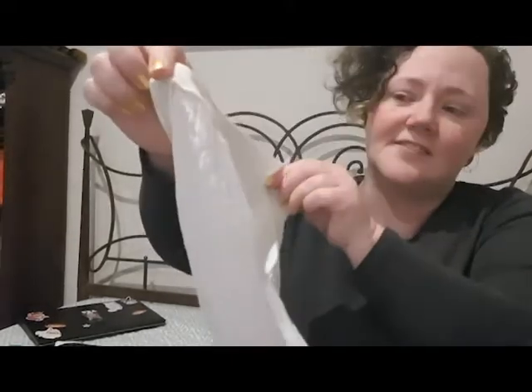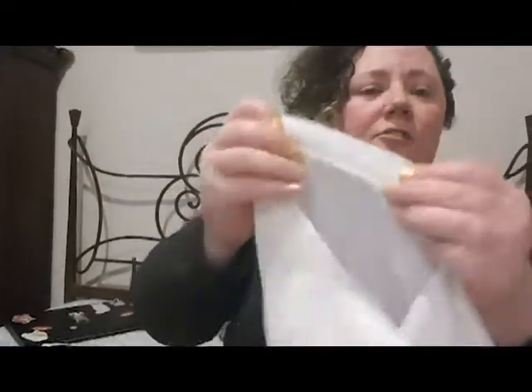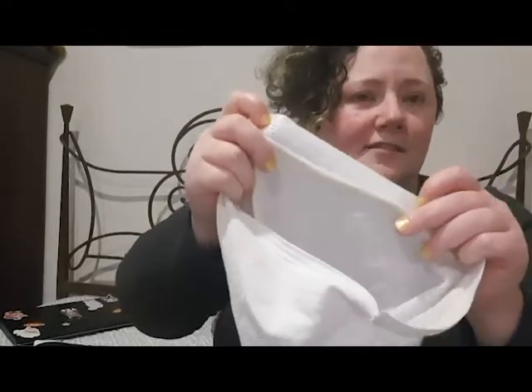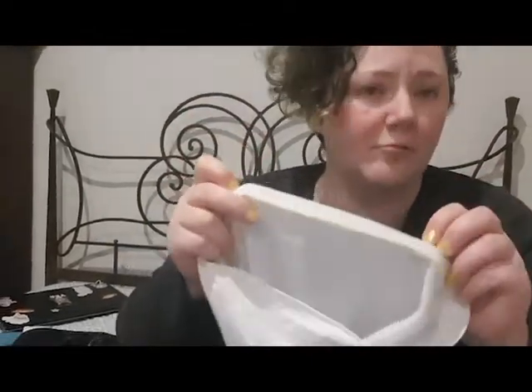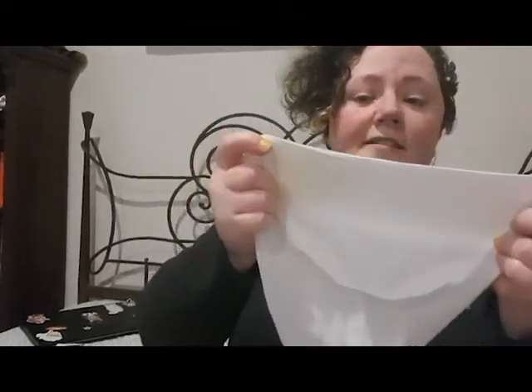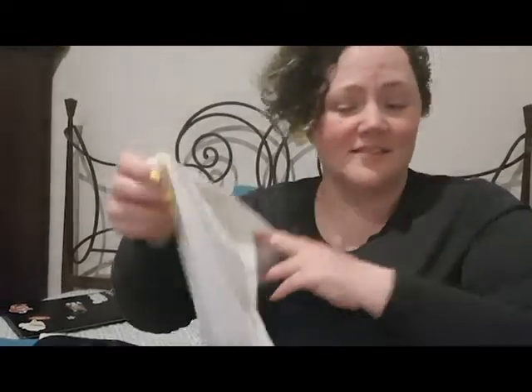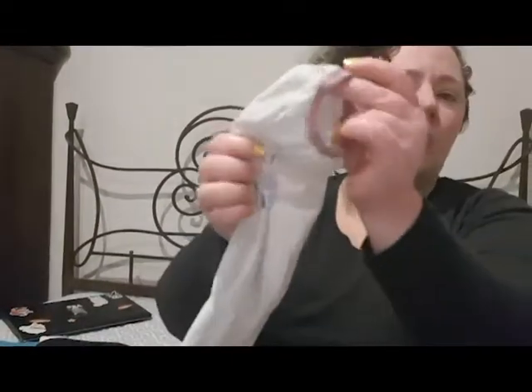This section is to go on your inner thigh, and that is because you don't want to have that right up against your nethers, because it will hurt, and it's not very comfortable. So this bit is sort of like an anti-chafing panel, and it's really useful to have that. It also means that you can keep track of whether the stocking is getting twisted when you're putting it on. It also has an open toe.